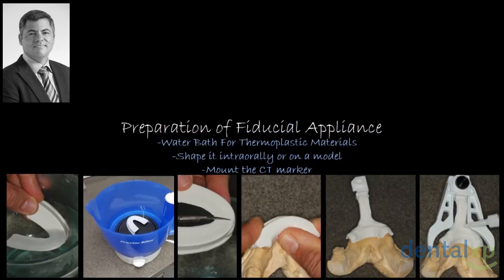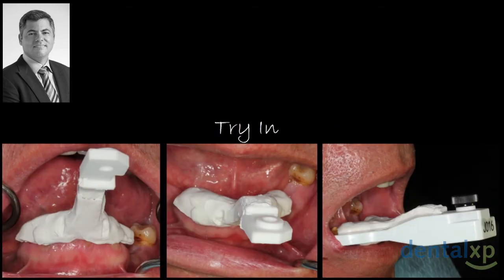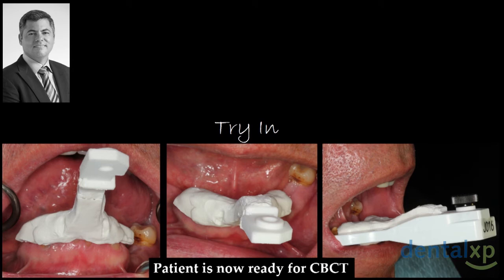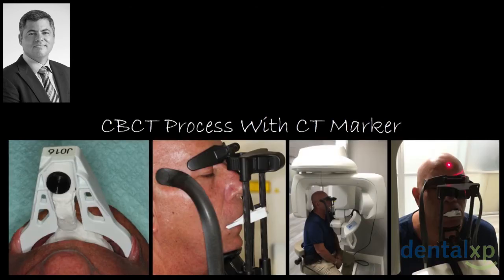The fiducial appliance basically is a thermoplastic material that you put in hot water and you shape it. Then you try it in the mouth, you make sure that it doesn't move and that it has a good fit, and then the patient is ready to be scanned.